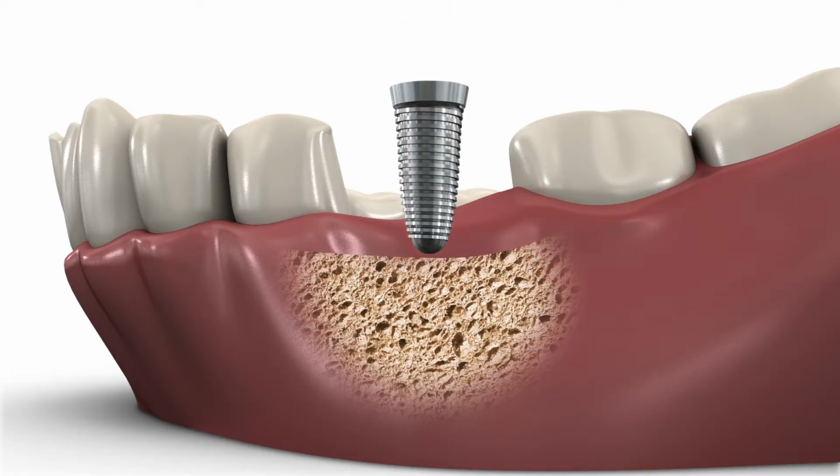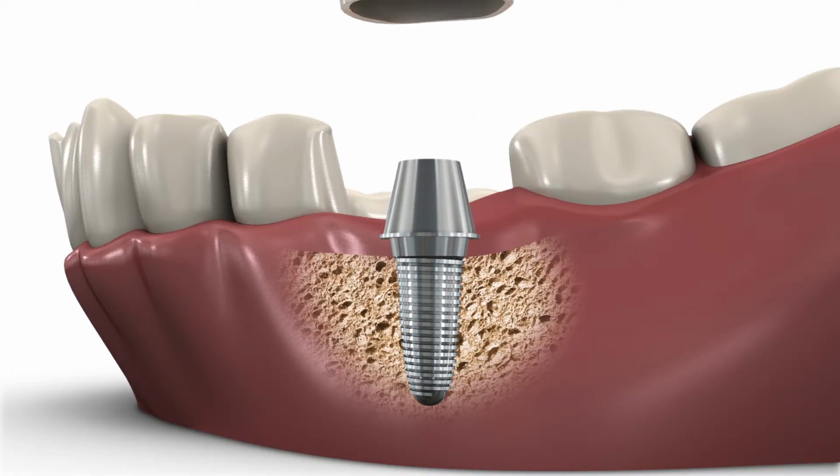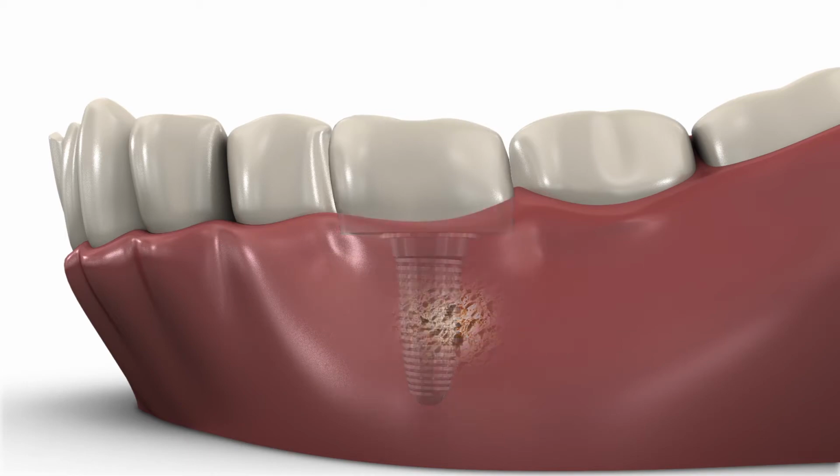By putting in a dental implant, the implant stimulates the bone around it, so it preserves the bone structure. Therefore, you maintain that space for a long time. That's the number one reason that we place dental implants there.